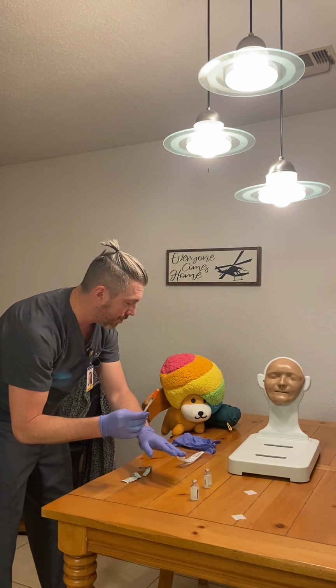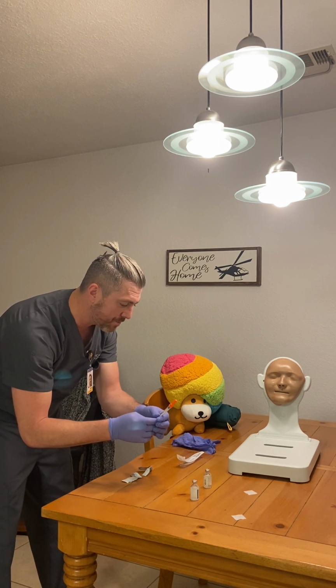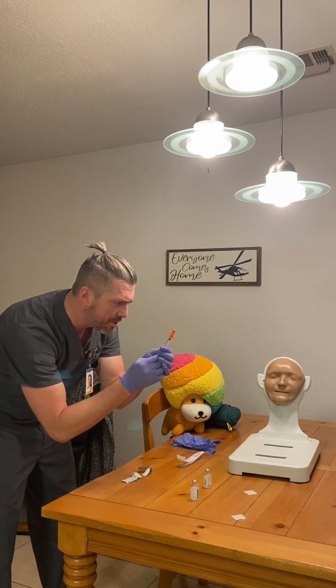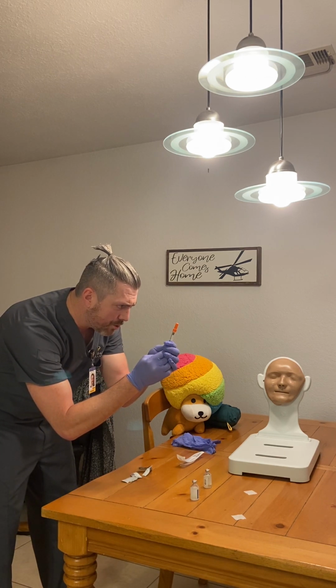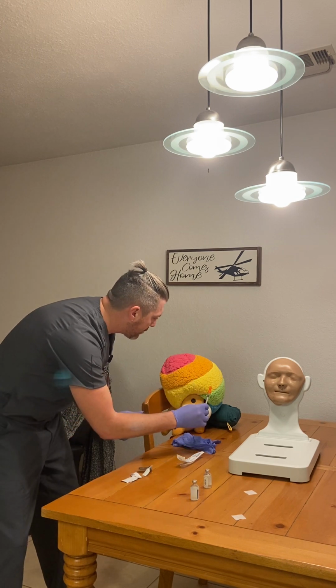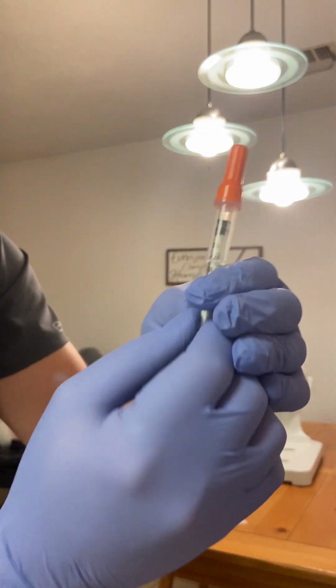We've gone over the order, and how much for each medication. So first I'm going to be drawing up the NPH. So I'm going to draw with the cap on the 8 units of air. I'll show it to my nurse, and then I'll show for the camera. Hopefully you can see that.